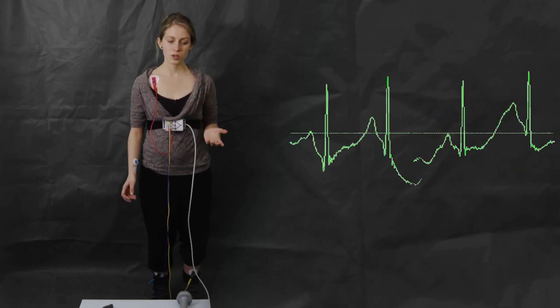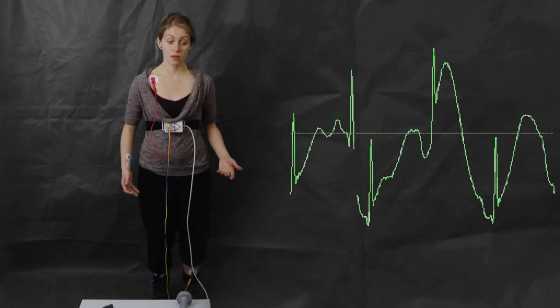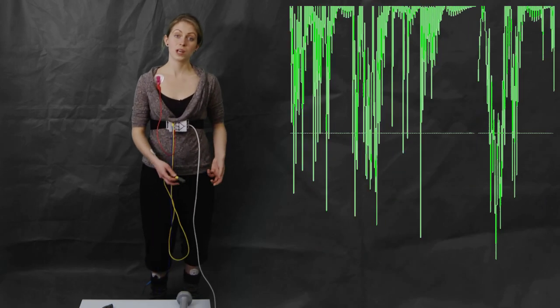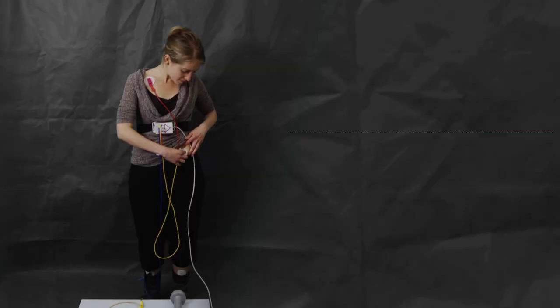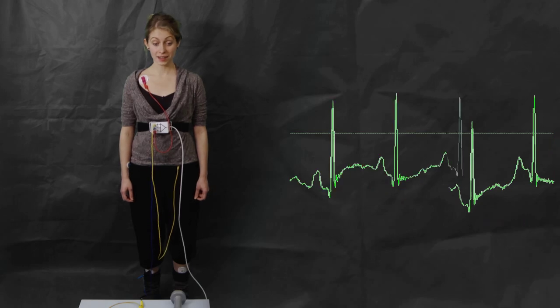And of course, we can do exactly the same with the connections down at my feet. So if I'm doing some exercising using my legs, then obviously I will get EMG noise coming from the muscles in my legs. So what I can simply do is just place an electrode a little bit higher, so somewhere near my waist, as I have here, there, and let's take a look at the monitor. And once again, the signal is nice and clean. So now we have found a way of eliminating noise coming from our muscular movement.